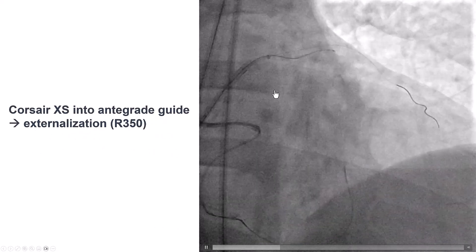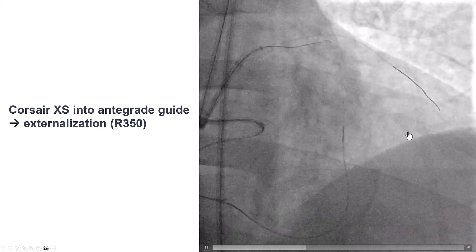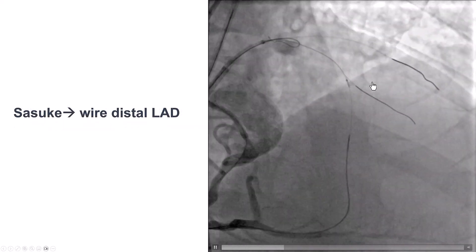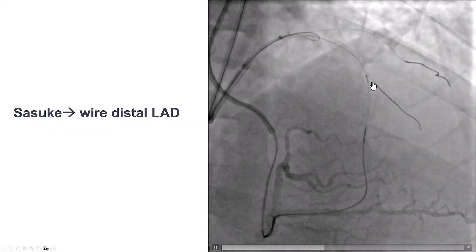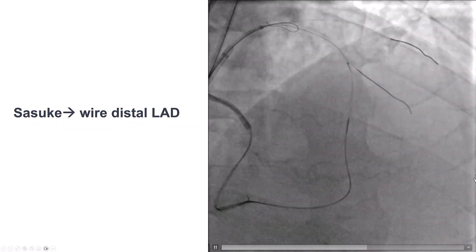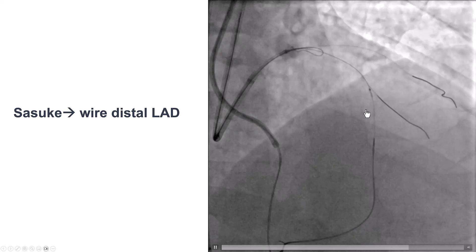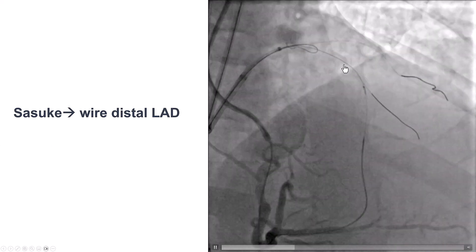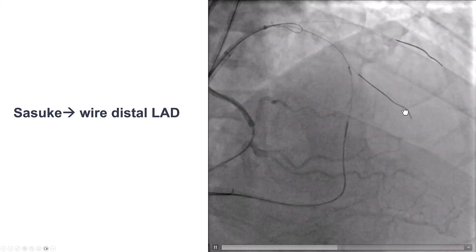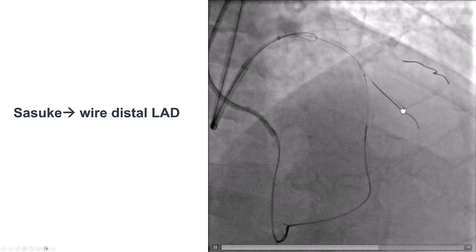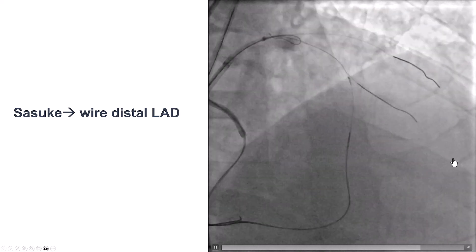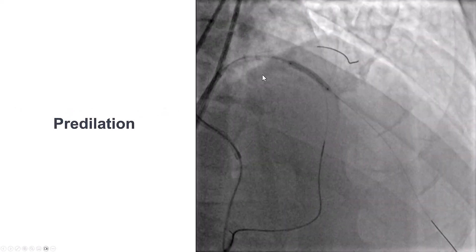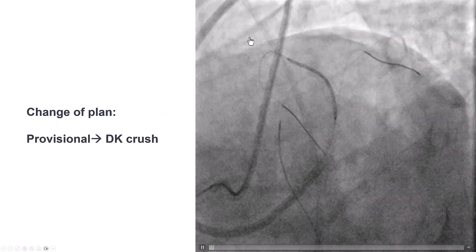We externalized, and then needed to advance an antegrade guidewire all the way to the distal LAD. We used a dual-lumen microcatheter — a Sasuke — and advanced a workhorse guidewire all the way to the distal LAD, then pre-dilated.